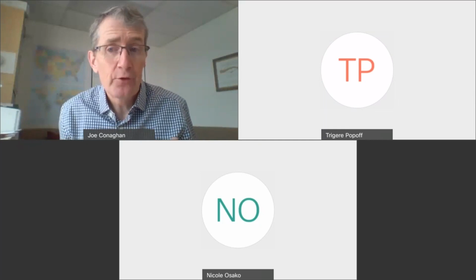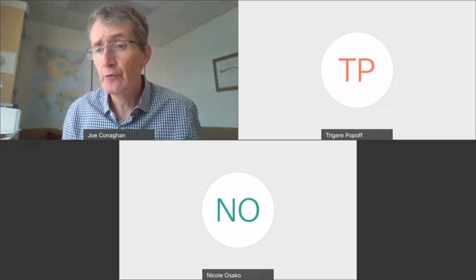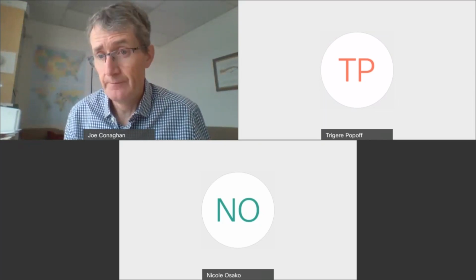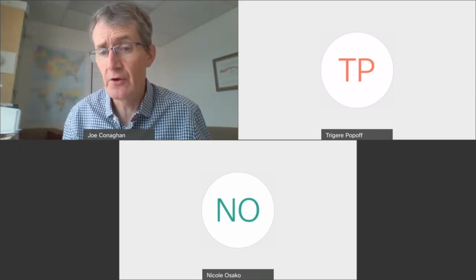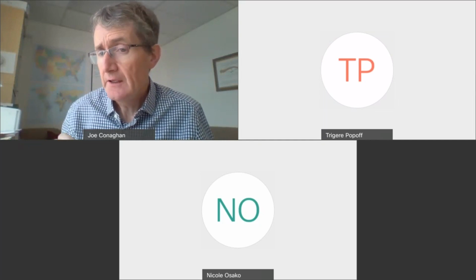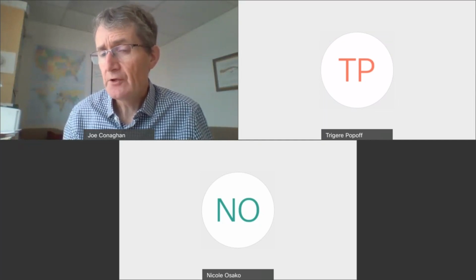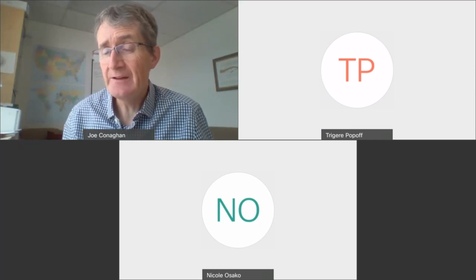The other way you can do it, and some people in my lab here in San Francisco do this, is you can remove the cap from the cryolock under the liquid nitrogen. Right, so then you just take the cryolock out of the nitrogen and go directly into the thaw solution. If you do it that way, you got to be careful because you got to do this relatively quickly, but you don't want to do it so quickly that you end up with liquid nitrogen in the thaw solution, right?